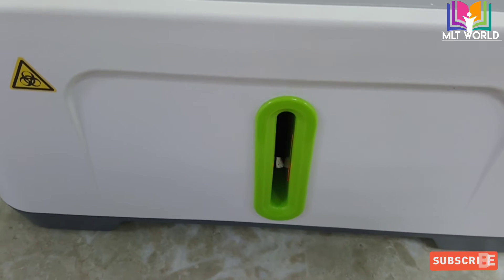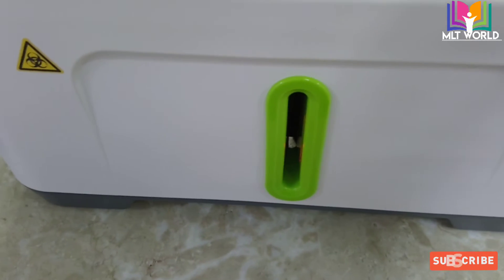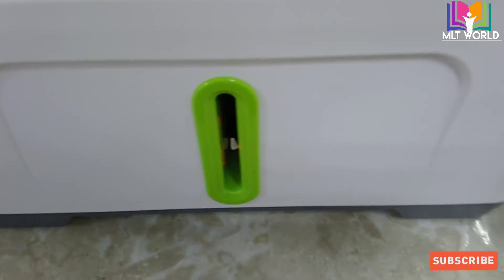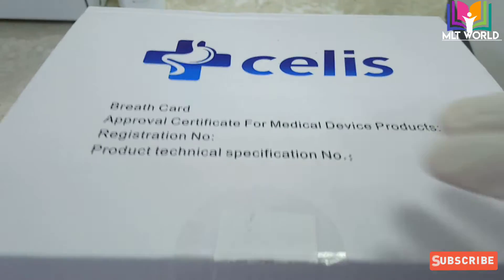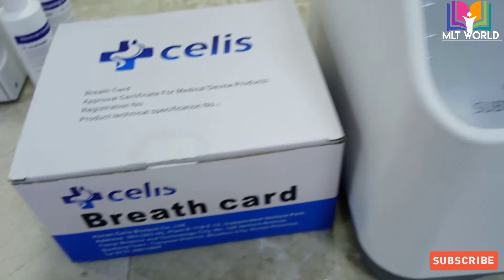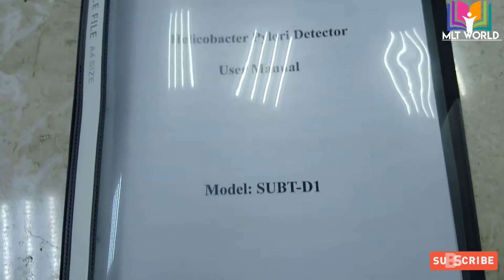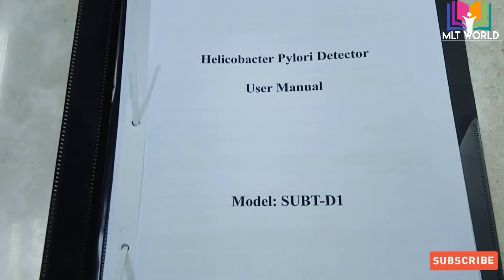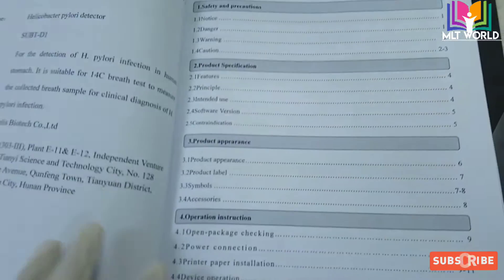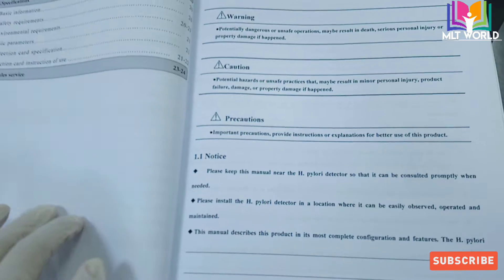Now we will again wait for the red color to finish and when the green color comes, we can process the patient sample. In part two of this video, if I get a chance and a patient is ready to be recorded, I will show you the process — how to prepare the patient, how to fill the card with air or breathing, and how to run the patient sample. I will upload that video soon.